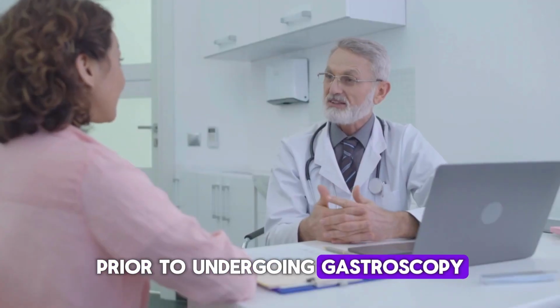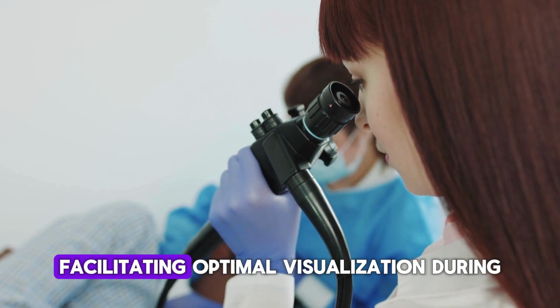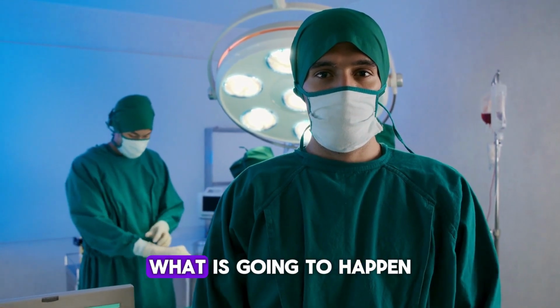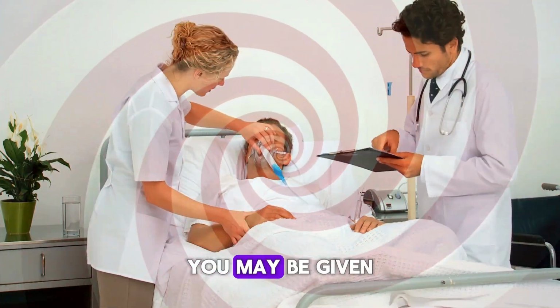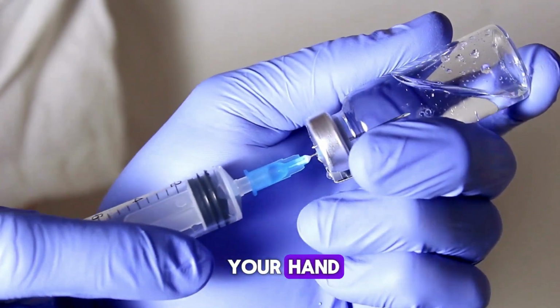Prior to undergoing gastroscopy, patients are typically advised to fast for a specified period to ensure the stomach is empty, facilitating optimal visualization during the procedure. Before the test, the operator will explain to you what is going to happen and ask you to sign a consent form. You may be given a sedative to help you relax. This is usually given by an injection into a vein in the back of your hand.